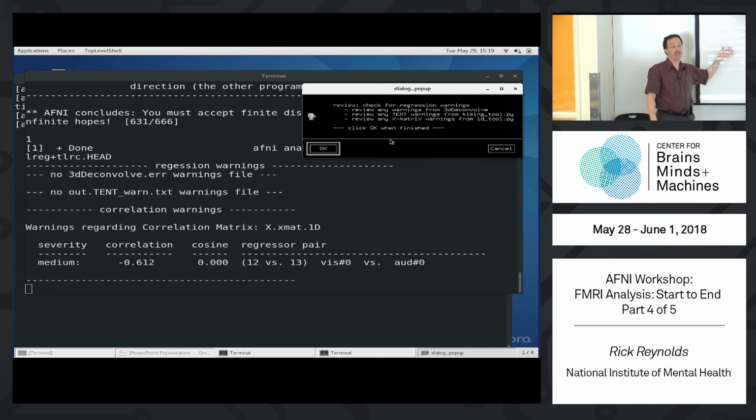Sometimes this will show baseline terms too. Sometimes motion will be correlated with the baseline terms. Well, because if the person shifts up during the runs, which happens, the delta will be correlated. If there are only 2 runs, the constant term in run 1, all 1s and then 0s, will correlate with the constant term for run 2, all 0s and then all 1s.